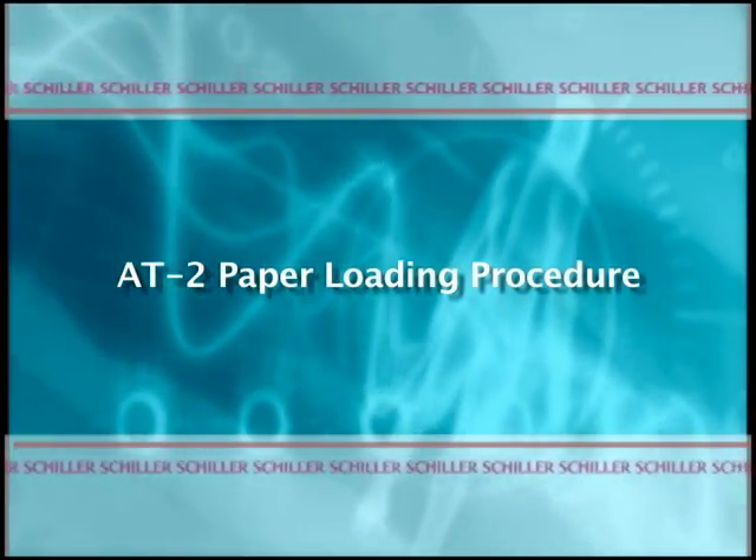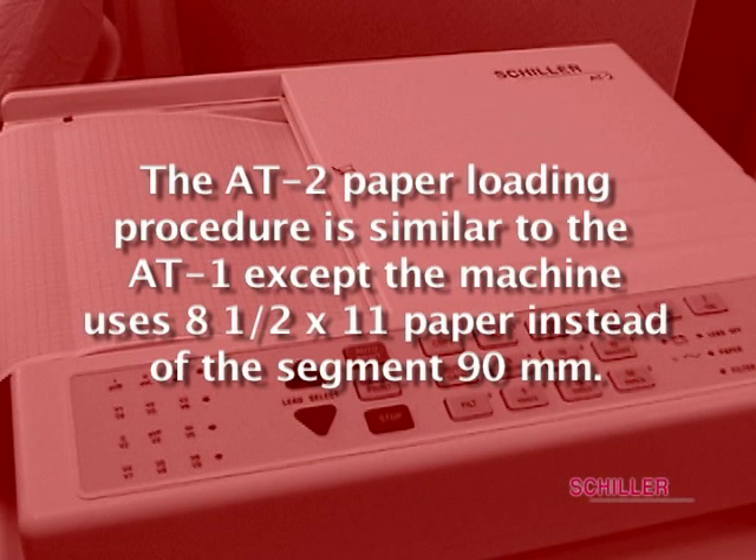AT2 Paper Loading Procedure. The AT2 paper loading procedure is similar to the AT1, except the machine uses 8.5x11 paper instead of the 90mm paper.